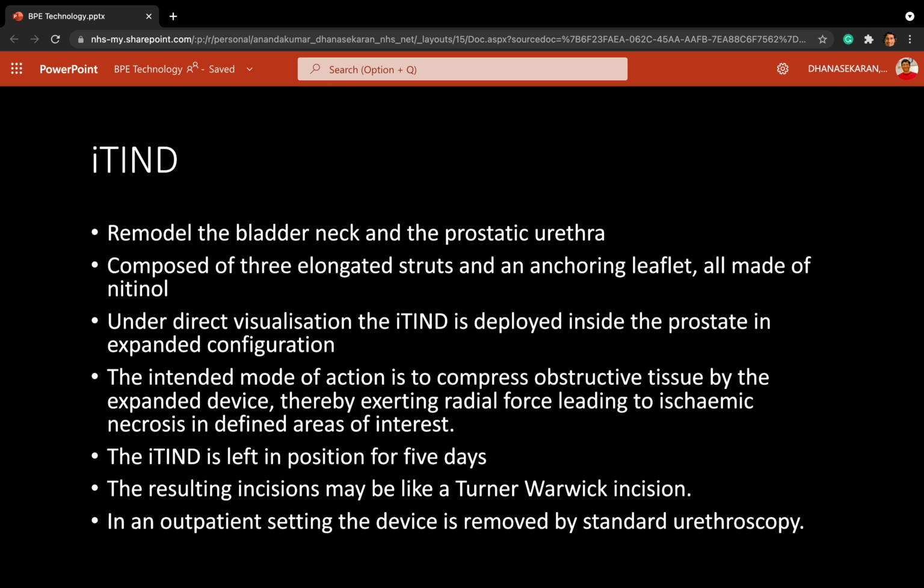how the UroLift works. So the UroLift, you have this stainless steel urethral tab which is held quite tight by the pet suture against the fixed nitinol capsular tab. So that creates a constant pressure for weeks and months. So that's why the UroLift has much better outcome, especially if it is appropriately applied, because the UroLift creates that continuous pressure for weeks and months, and whatever the channel you have produced in the UroLift in the immediate post-op will be much better if you do a flexible cystoscopy in 3 months time.